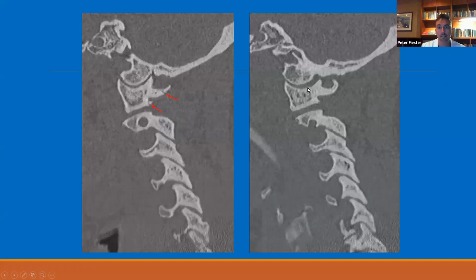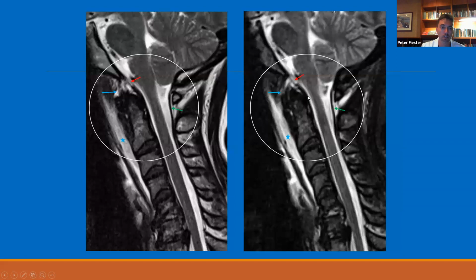Like I said, we had half a dozen of these cases where it's just very underwhelming on CT, and the MRI just shows all these ligament tears. So I think it feeds into that prior discussion about the difference between the radiology findings and sometimes the clinical and CT findings.